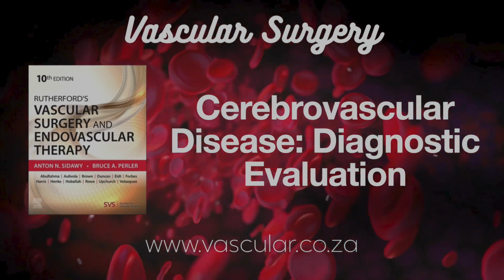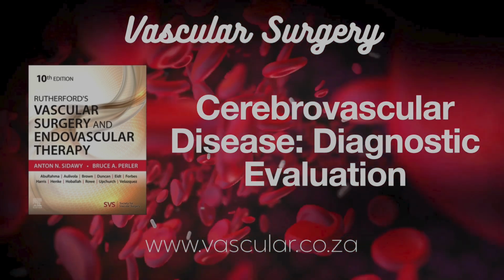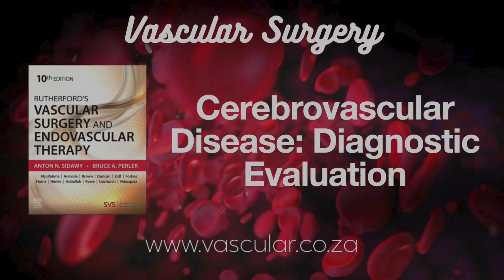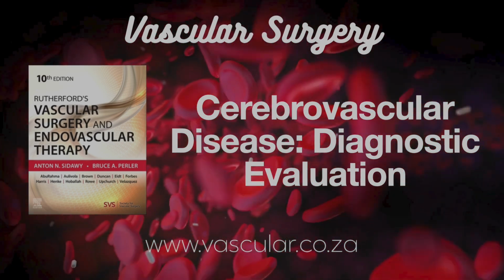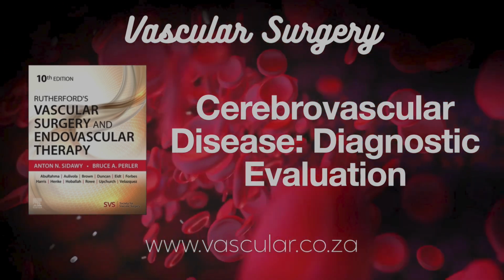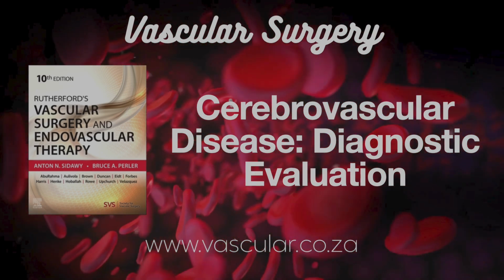Exactly. And it gives us these incredibly detailed 3D images. We're talking sub-millimeter resolution. Plus, it shows not just the vessels, but the surrounding tissues, bone, everything all at once. It's a much more complete anatomical map. That sounds significantly more detailed than ultrasound. Yeah. What are the big advantages of CTA?